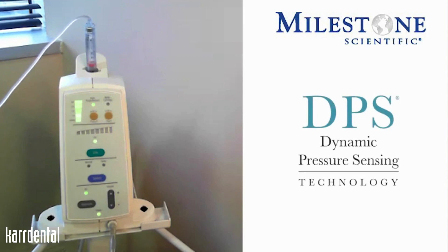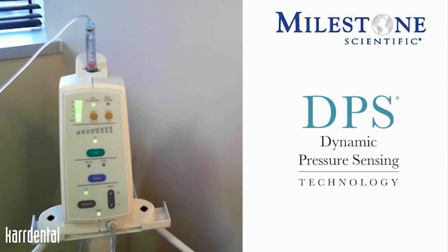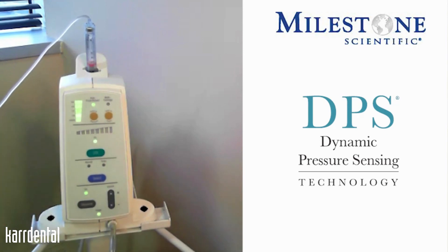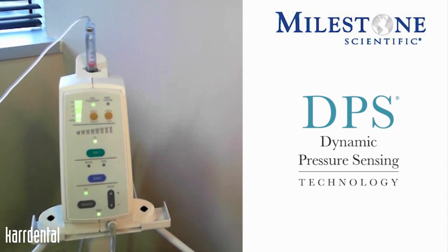Dynamic pressure sensing works in conjunction with the single tooth injection, and this horizontal scale represents that DPS. If and when you are doing that single tooth injection and your needle placement is correct, you will begin to see that scale light up for you. This scale during that single tooth injection also becomes a measure of pressure — so the more lights you get lit up, the more pressure you have within the area of the sulcus.